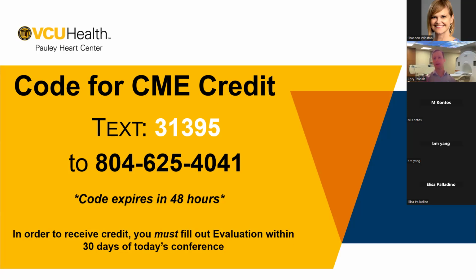I think one thing that we always are cognizant of is that if you can exercise people and image simultaneously, that gets around the whole issue with heart rate decay, but it also allows you potentially to have some respiratory correction and only accept the cardiac cycles that occur at end expiration.